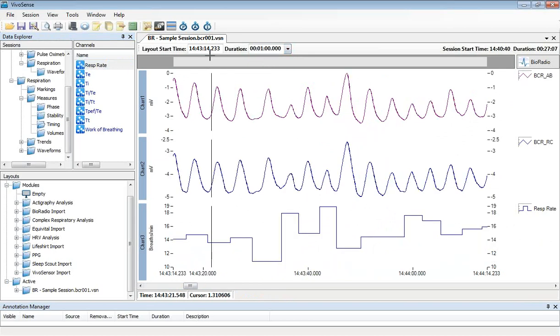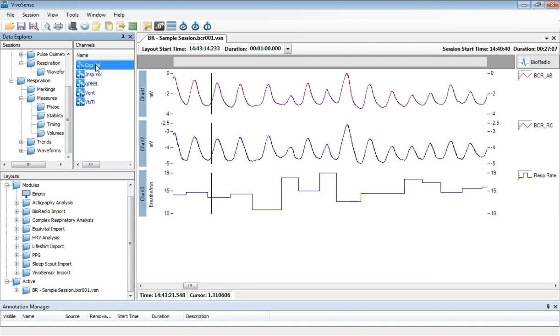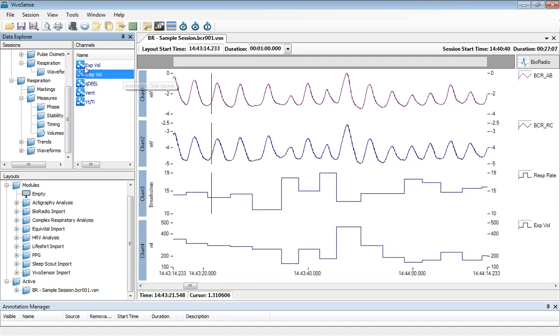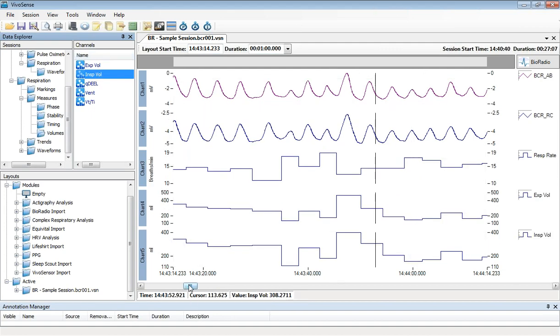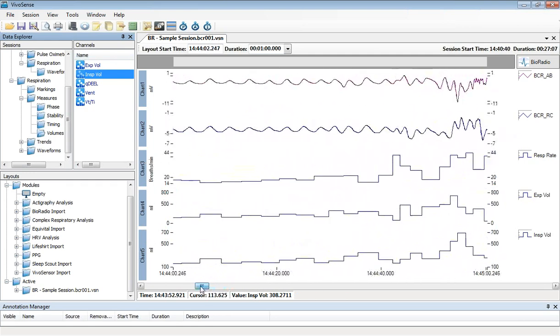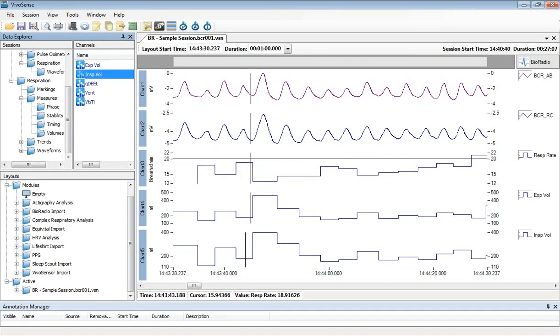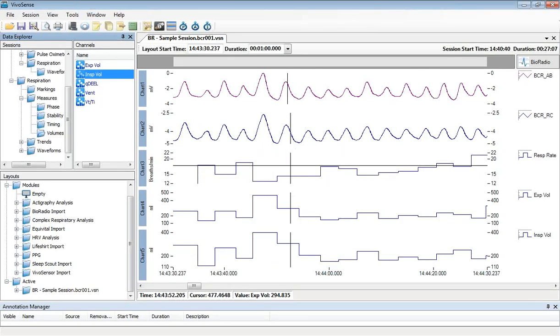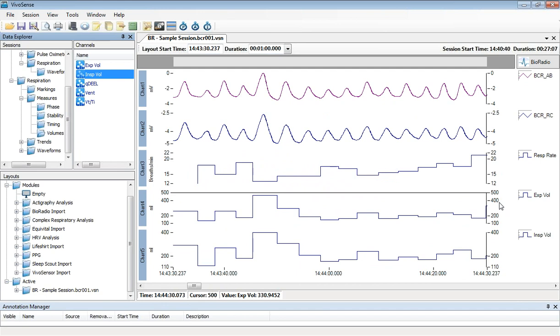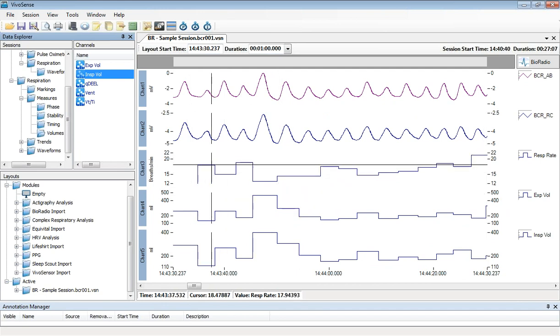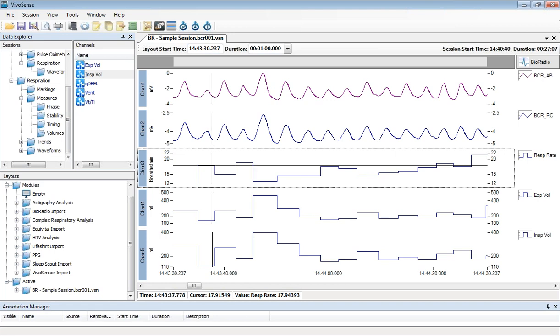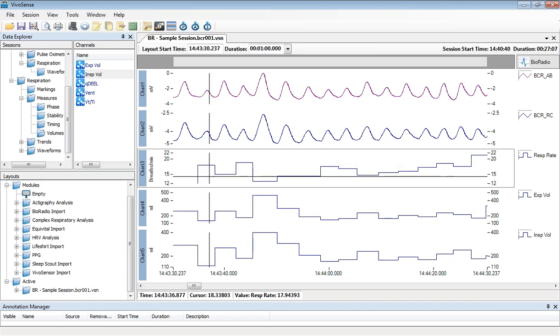In addition to the raw data and respiratory rate, you can also quickly look at volume. Clicking on volume here and double-clicking on expiration and inspiration, I can look at the volumes of both. Again it's dynamic, so as you scroll through you can look at the volume occurring over different time phases. While looking at this in graphical format, you can also export all of this data to get the numerical value in addition to the raw data.